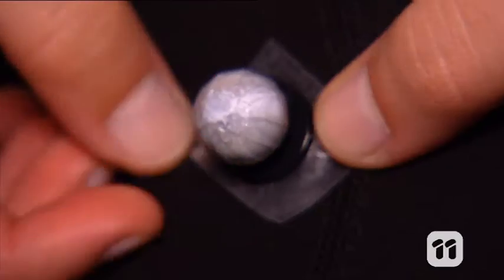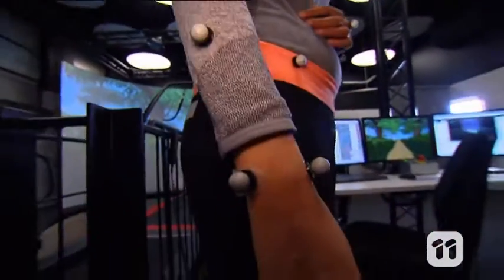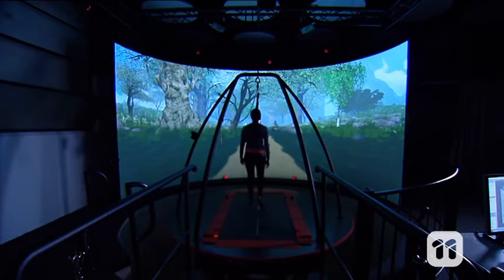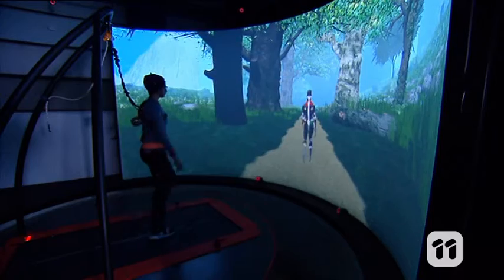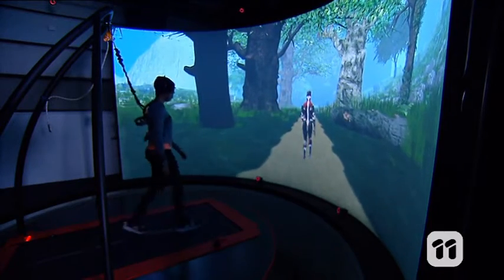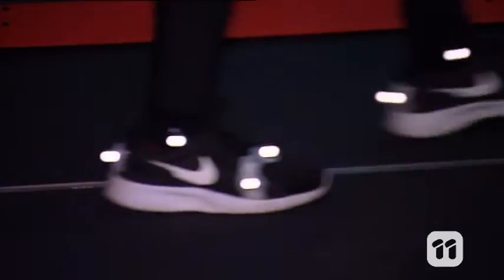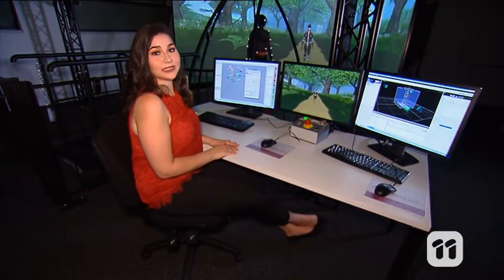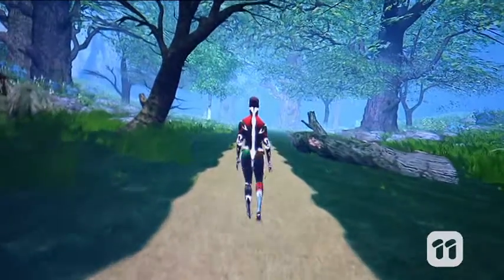First, we place these reflective markers on our volunteer's body. They are picked up by infrared cameras and track the movement of the person. The volunteer then stands on this treadmill, which moves as the subject moves, simulating walking on the ground. The movement captured by the cameras is then applied to a computer-generated model.